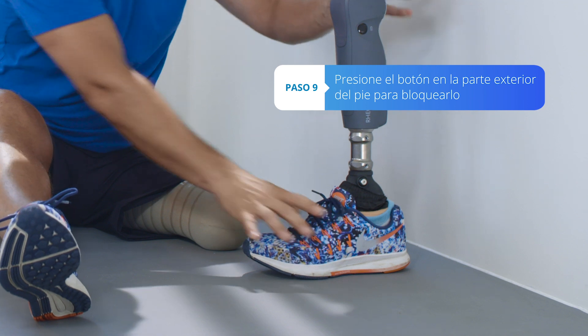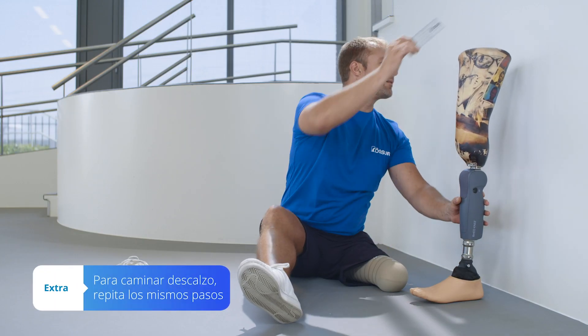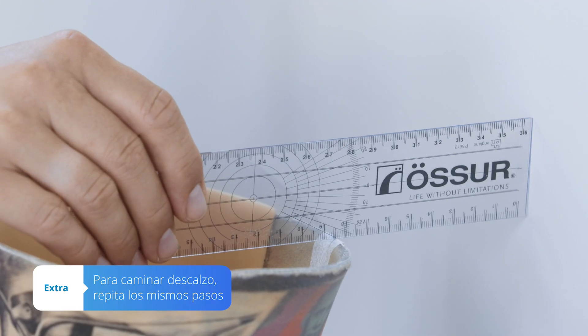Your prosthesis is now safe to use. To walk barefoot, follow the same steps to align your prosthesis correctly.